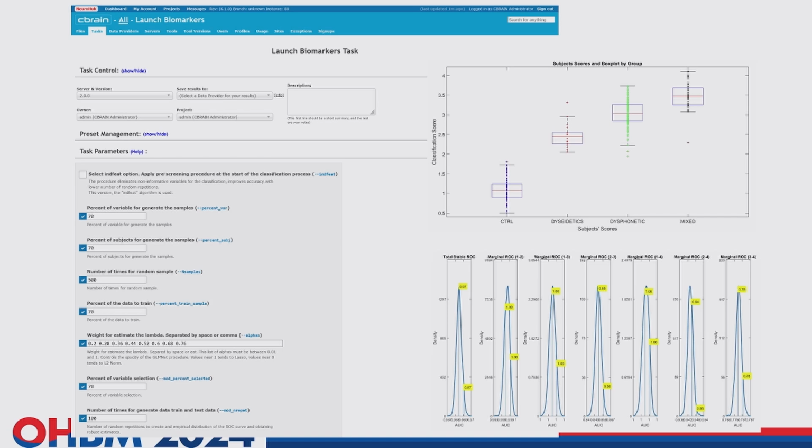Database? Yes, this is the normative database that we use in the harmonized qEEG, that, as I said, is a project that we did within the framework of the Global Brain Consortium, and we collected databases from 14 groups working in 9 different countries, around 1,600 subjects with an age range from 5 to 85 years old.